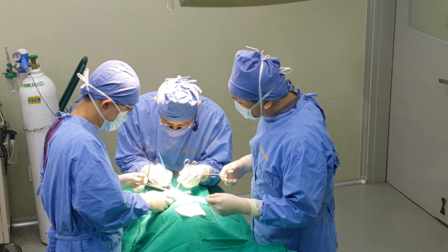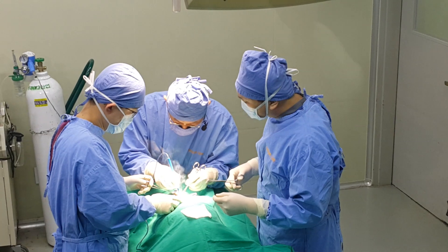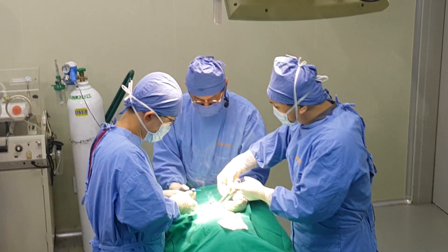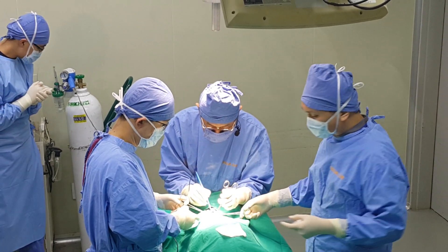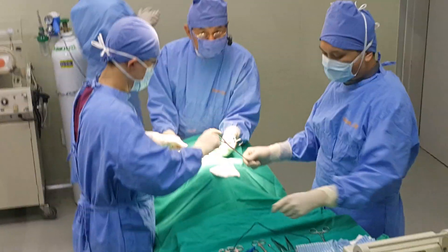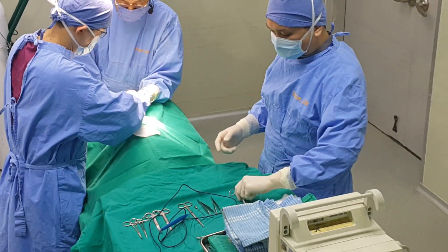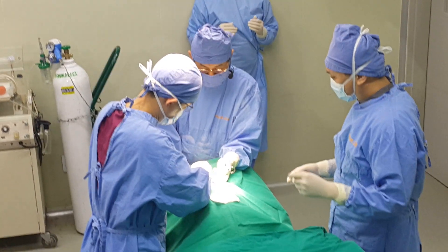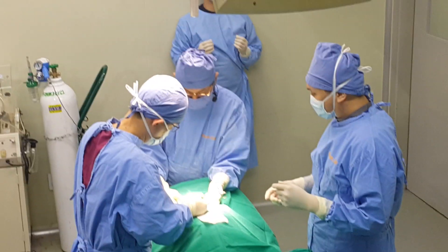We will transfer the embryos. If you can see the video on the screen, those are the cloned embryos that we will transfer into the surrogate mother. Essentially he's putting the embryos into the mother — not taking them out. This is the implantation procedure.